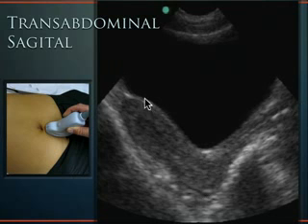So this is where the glass part is over here, and the cervix is down here, and that's the part that you twist into the light. Okay, that's kind of how I think of the uterine anatomy and the cervix. Now, this hyperechoic line, this white line that you see right here, that's the vaginal stripe.